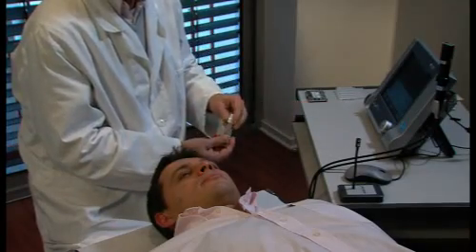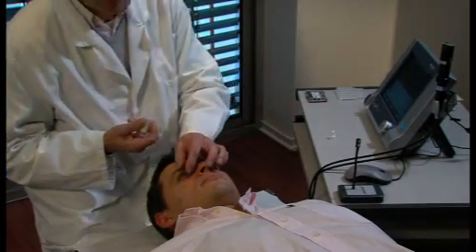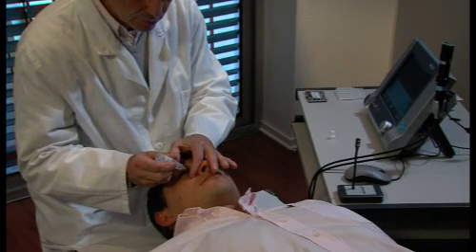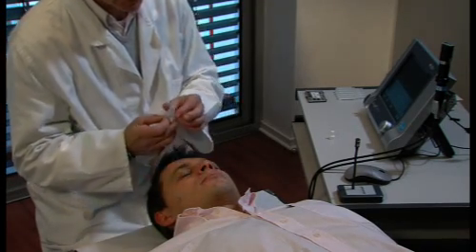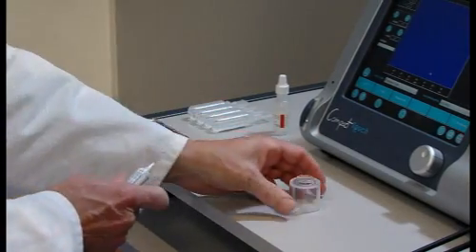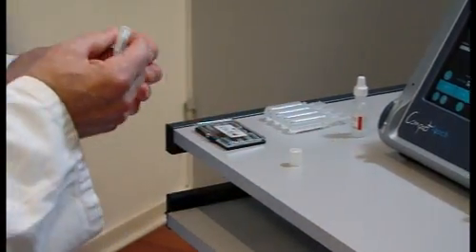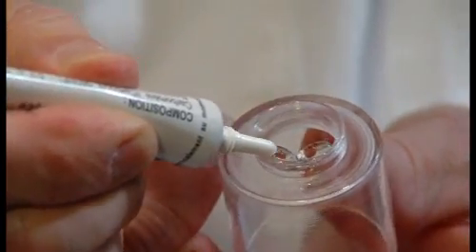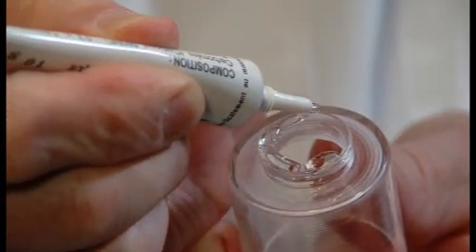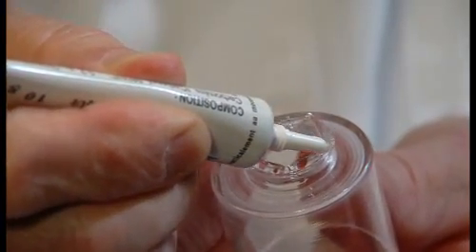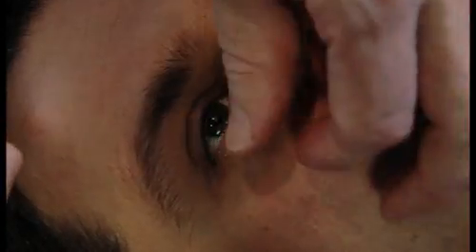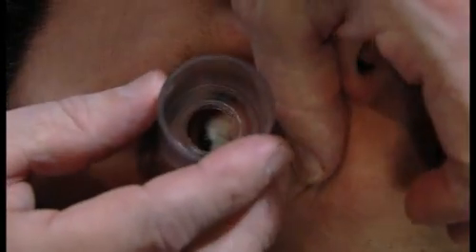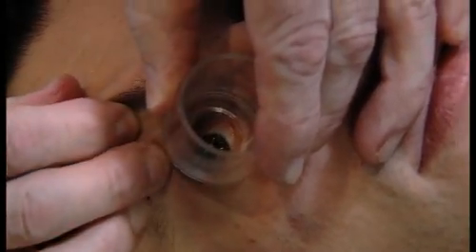The patient must be lying down. The operator then instills anesthetic drops. An ophthalmic gel is applied onto the scleral shell supplied with the device. The shell is then inserted into the eye. This is a very important step. The eye must be perfectly centered.